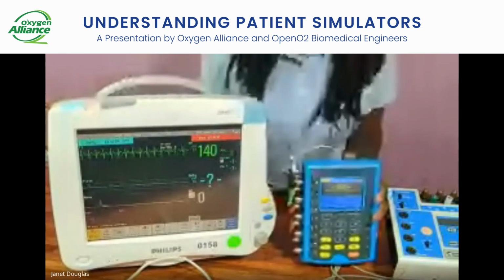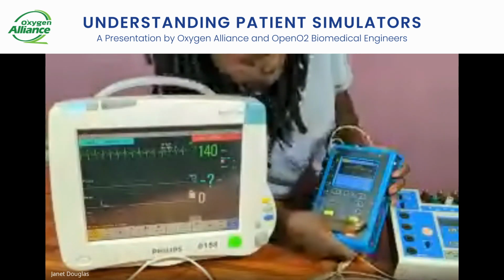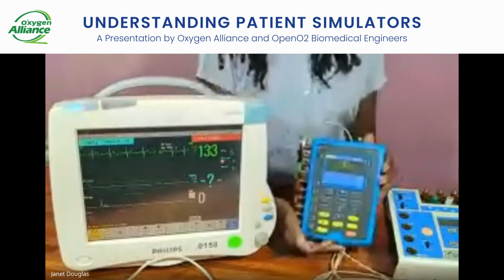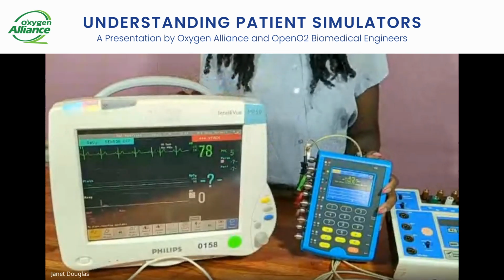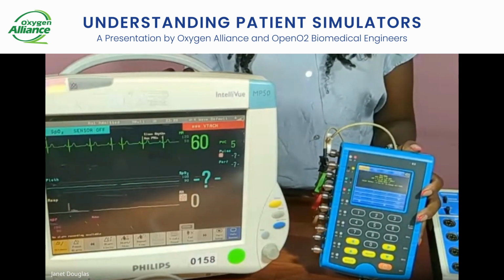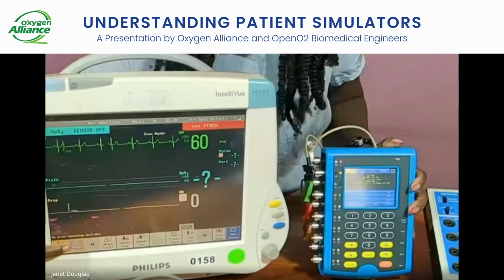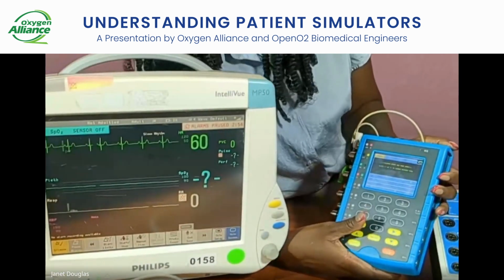So these are the things that you're supposed to see inside the alarm. But if I try, let's say, to reduce this, to put it in the normal ranges, let's say 60 beats per minute, and then I click OK, the monitor itself also has to adjust and reduce to 60 beats per minute. So as you can see, the readings are changing. And now we are on 60 beats per minute. All right, so you can clear that and also change.